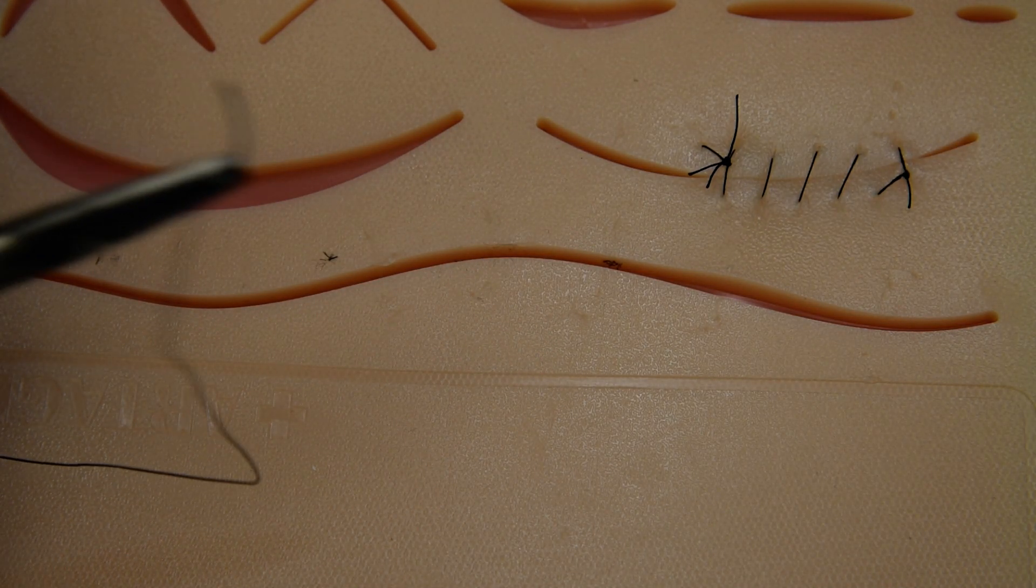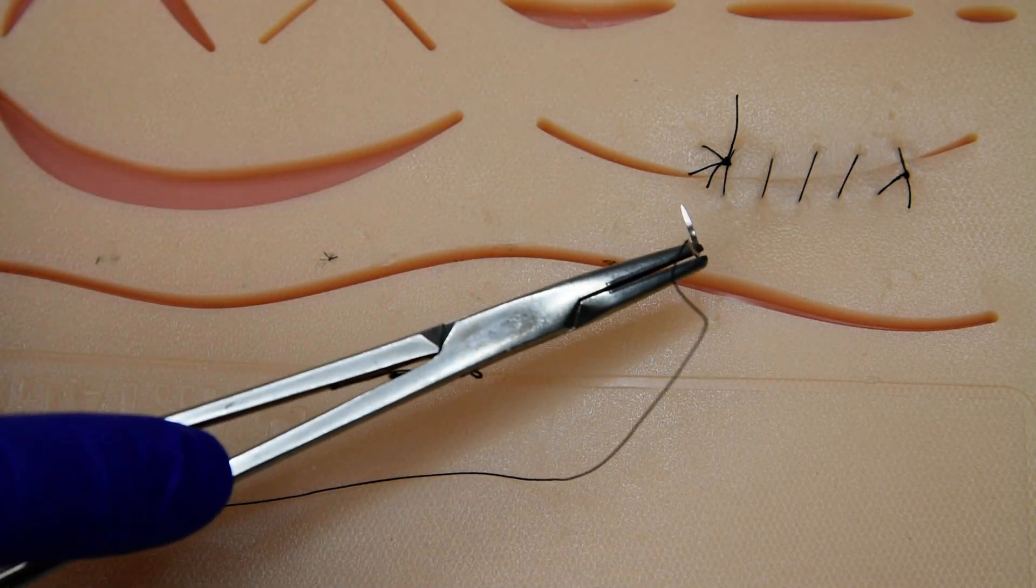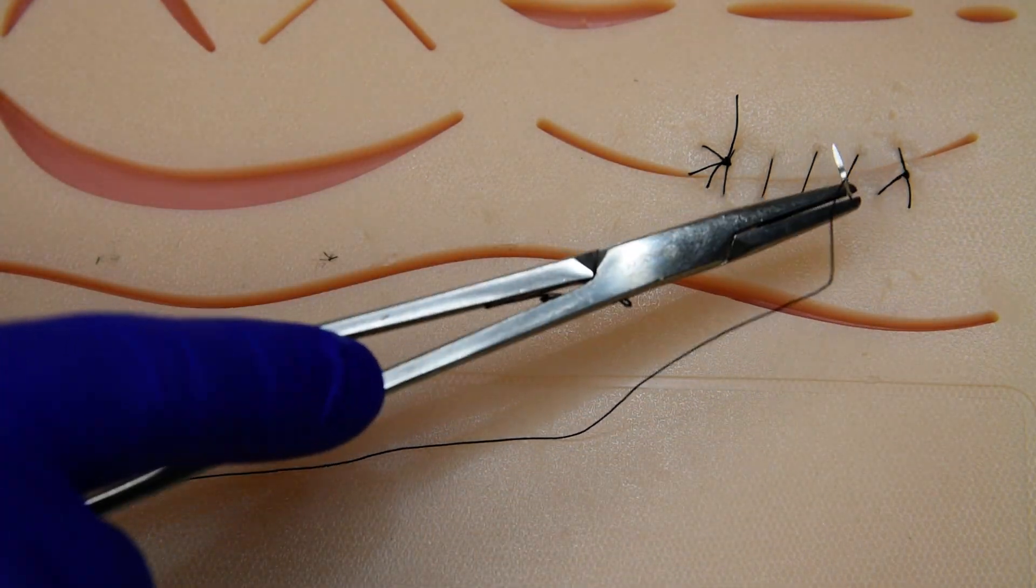Let's show you a single interlocking continuous. Here we have our simple continuous which is interrupted and then tied to a final knot.